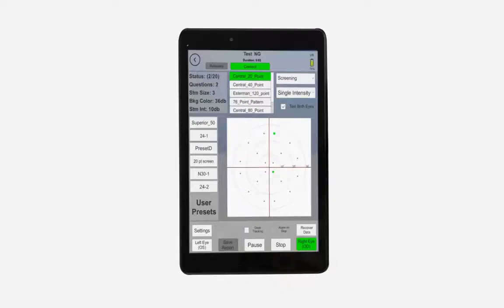The VF2000 also notes any false positives or negatives produced during testing so users can understand any parts of the test that need to be repeated.